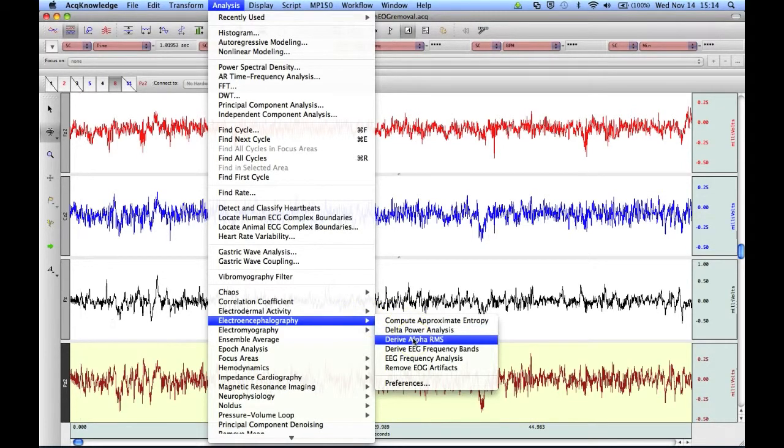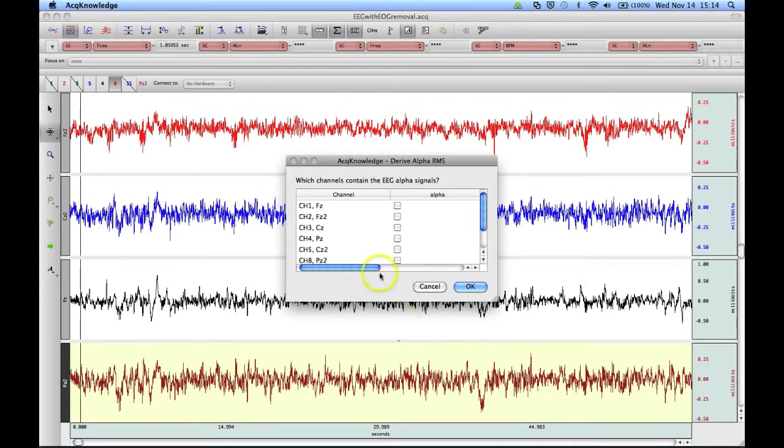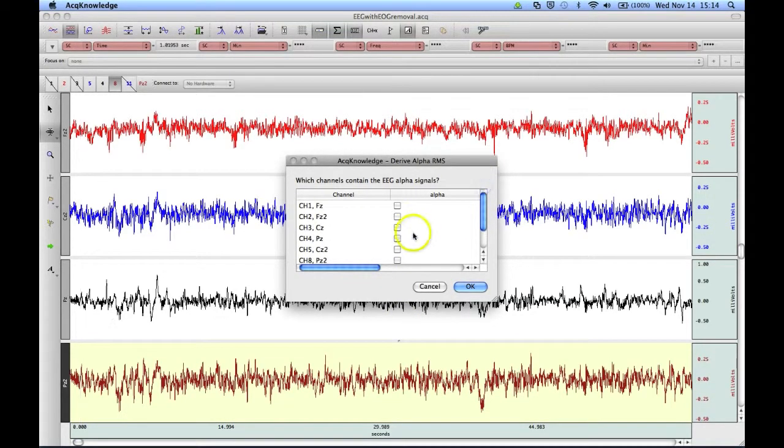Let's start with Derive Alpha RMS. After we click on it, we'll see a dialog box that shows all of our available EEG channels.